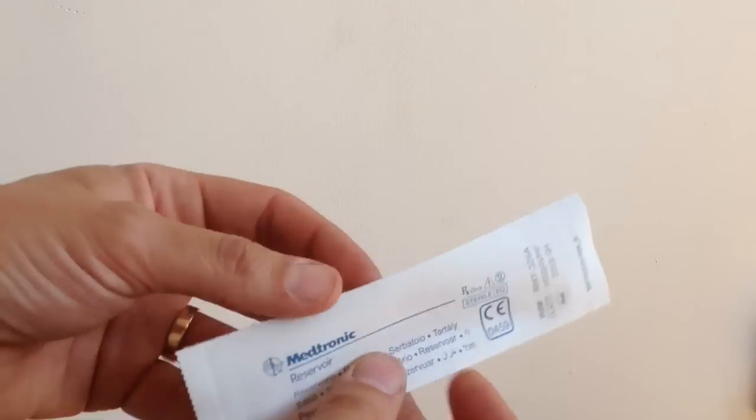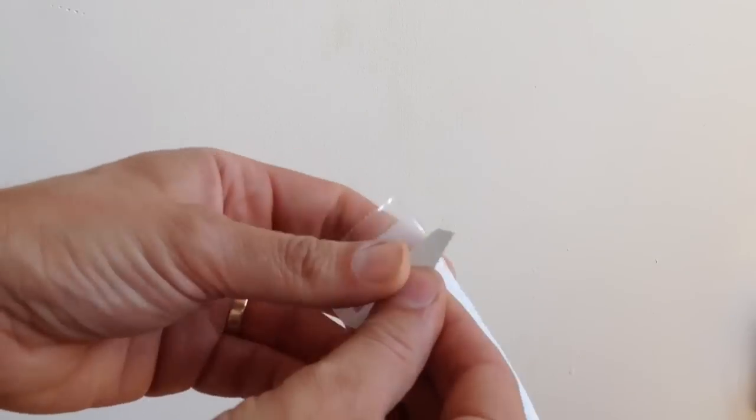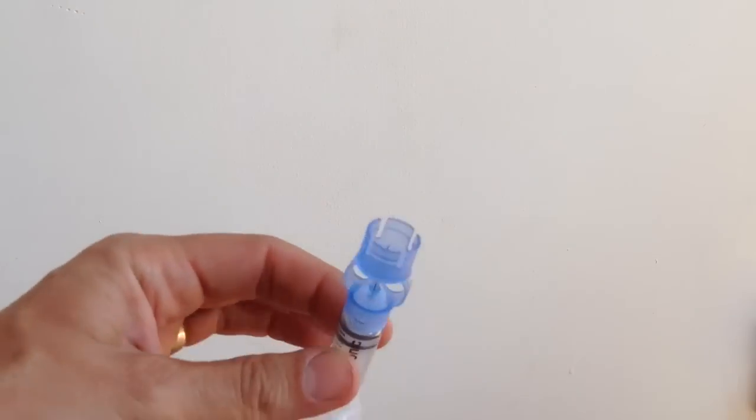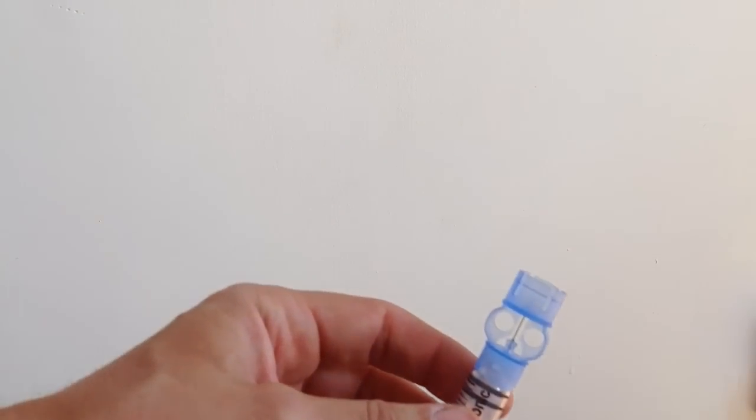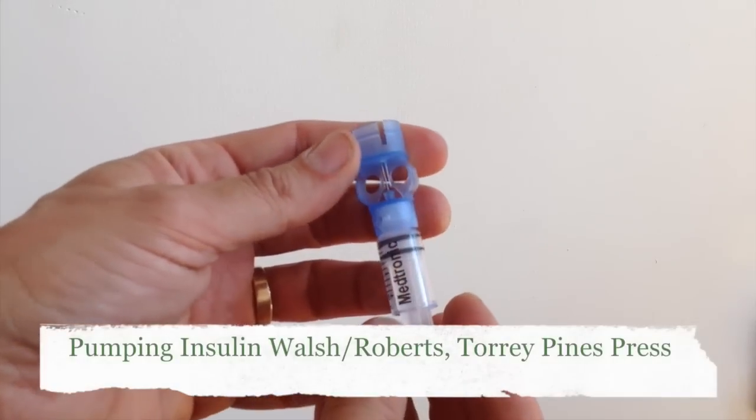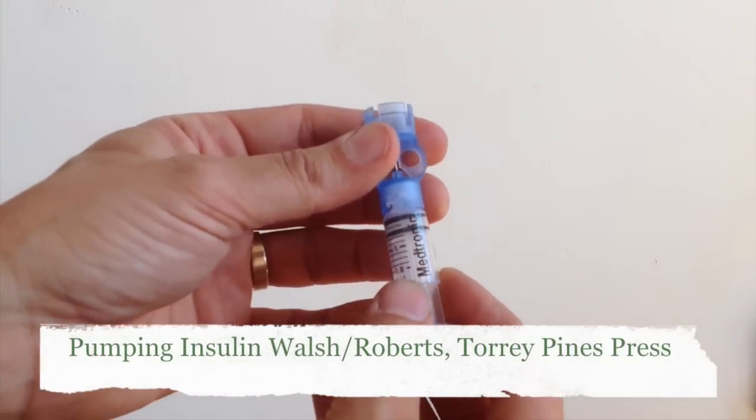So the reservoir comes like this from Medtronic, you just unpeel the end there, and there's the little filler thing. Now, I think it was from Pumping Insulin, John Walsh and Ruth Roberts, that the suggestion came that the first thing it's useful to do is to just work the plunger up and down to the level at which you're going to fill it.